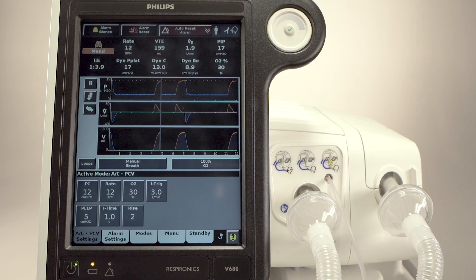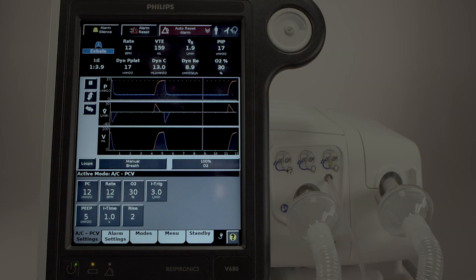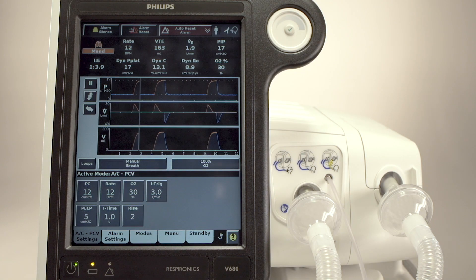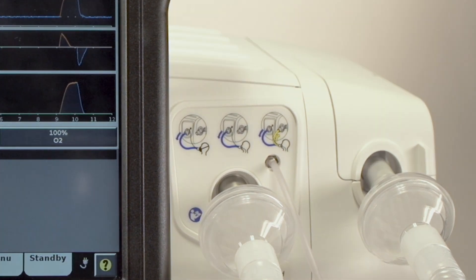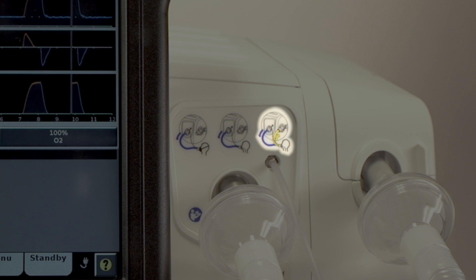Beginning at the front of the ventilator, let's first look at the screen. The Graphic User Interface, or GUI, is designed to be familiar, simple, and intuitive. Circuit connections are well-marked, and pictograms indicate the connections for single-limb non-invasive, single-limb invasive, and dual-limb invasive ventilation.